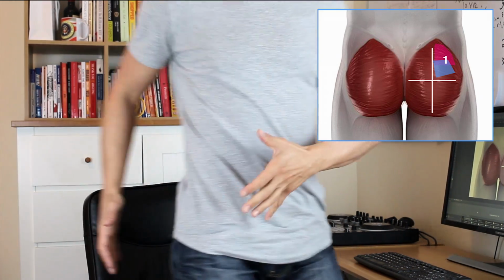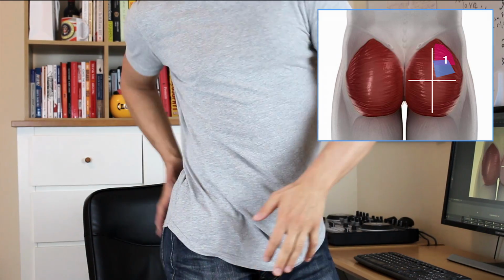Now, when you do a glute injection, you actually have to twist and look back at your own glute. You've got to try and twist and look at it. It's hard to visualize exactly where the lines are so that you can choose a quadrant or a quarter where you need to put the needle in.